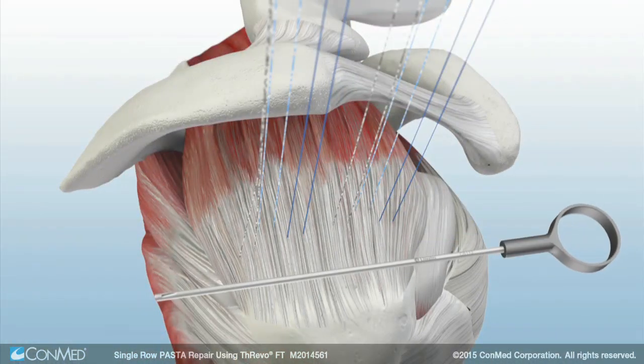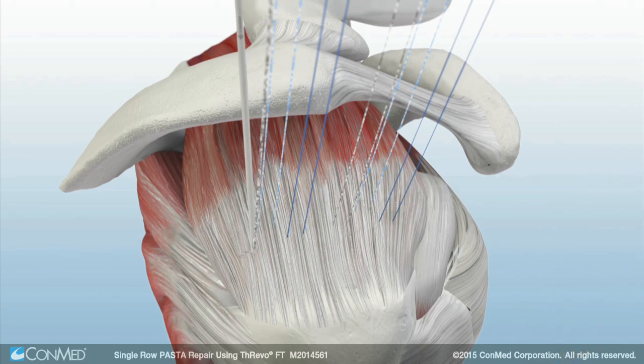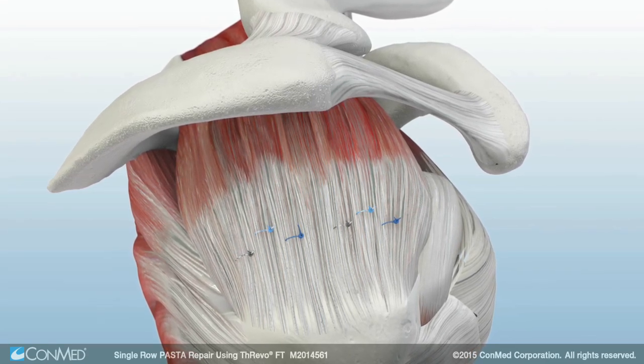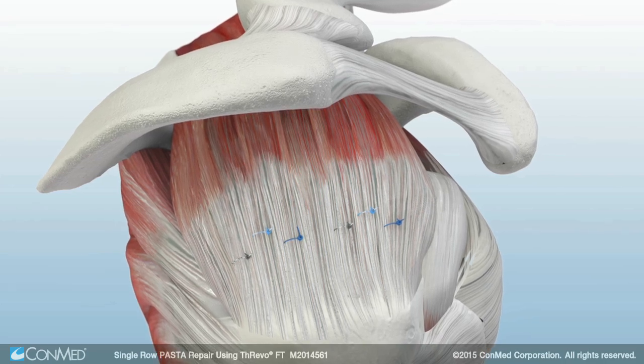All knots are tied from the subacromial space and the katana suture cutter is used to cut the suture tails. The final construct will have six horizontal mattress stitches compressing the supraspinatus tendon back down to the footprint, with the lateral edge of the footprint still intact.